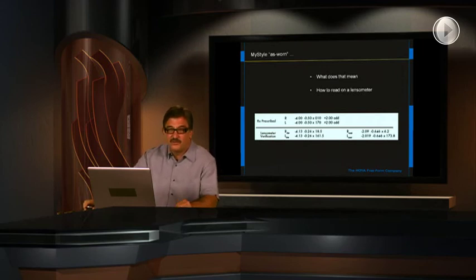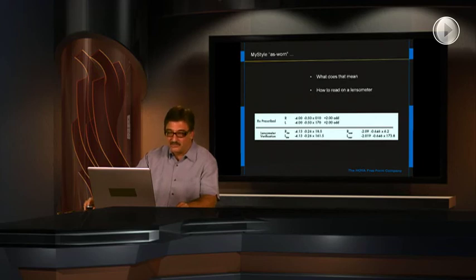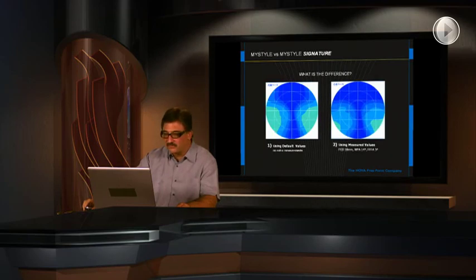And most of your conventional lensometers are not going to be able to interpret this, so we're going to give you a document that will give you both the ordered powers and the powers that you will now read through a lensometer so that the patient will be able to see as refracted in the ordered powers. This is what we call the as-worn position adjustment of Rx powers.